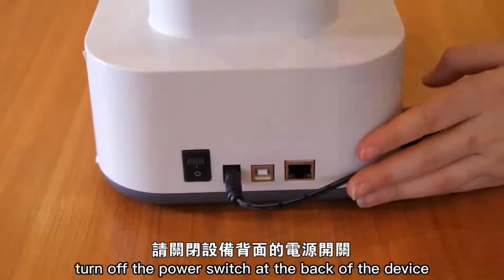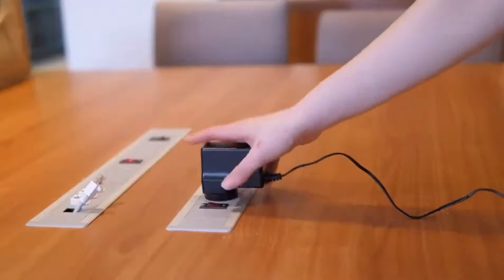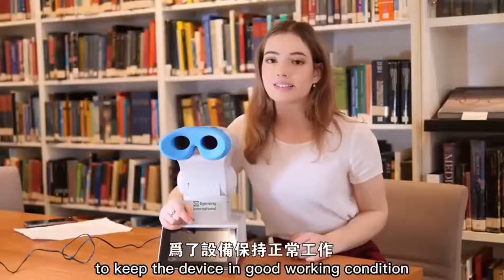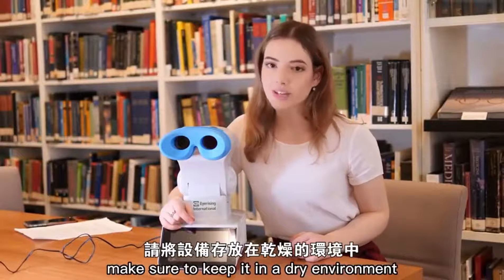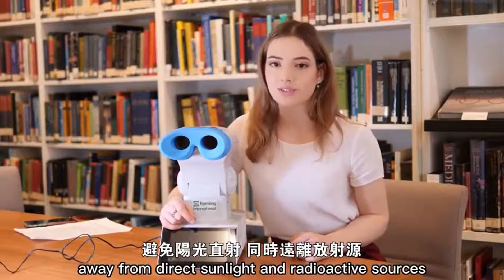After each use, turn off the power switch at the back of the device. To keep the device in good working condition, make sure to keep it in a dry environment away from direct sunlight and radioactive sources.